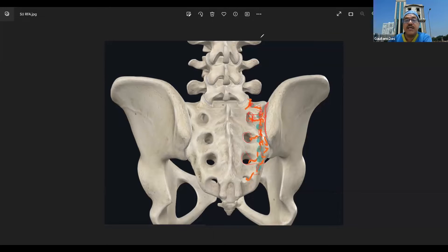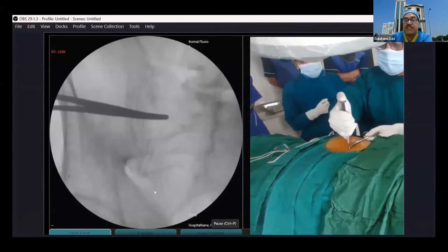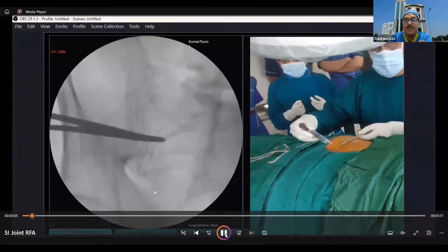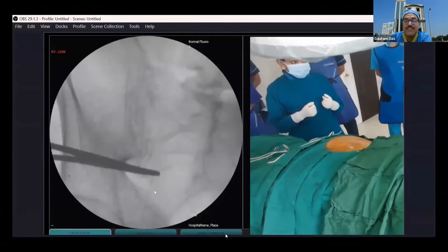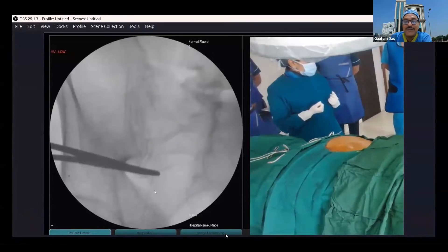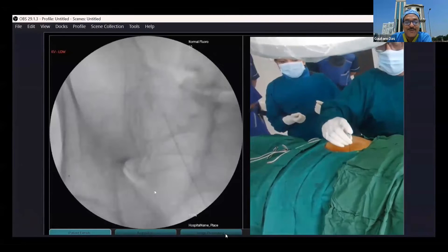So with this basic anatomy, let me start the video. This video has been fast-forwarded, which is why there appears to be movement. This movement is due to respiration — because I have fast-forwarded it, it is looking like a convulsive movement, but these are not convulsive movements.